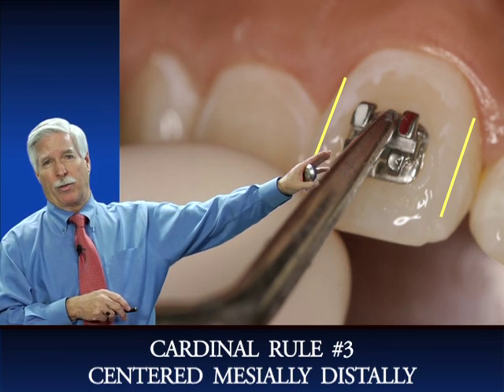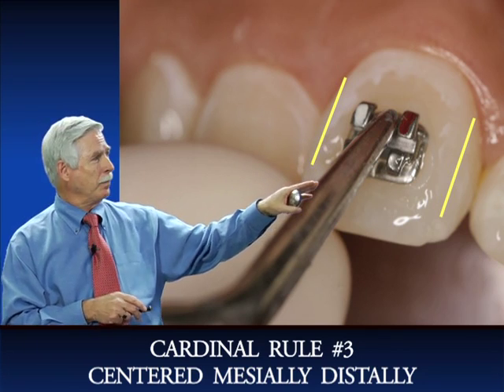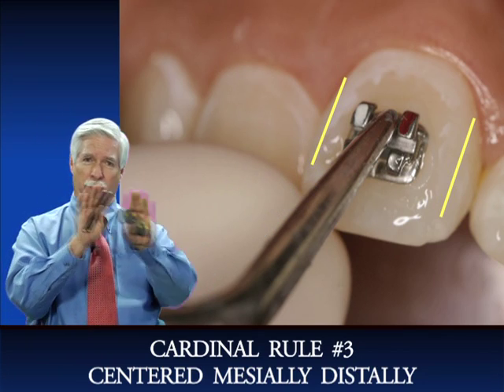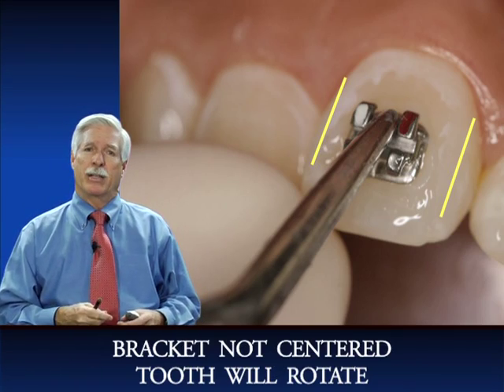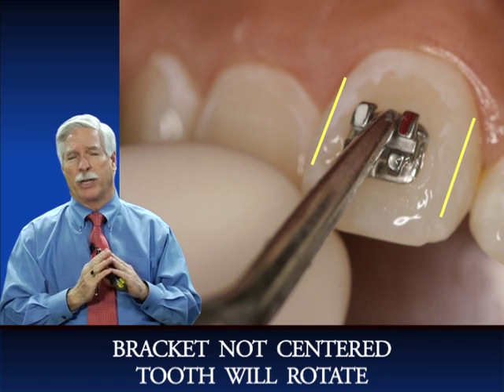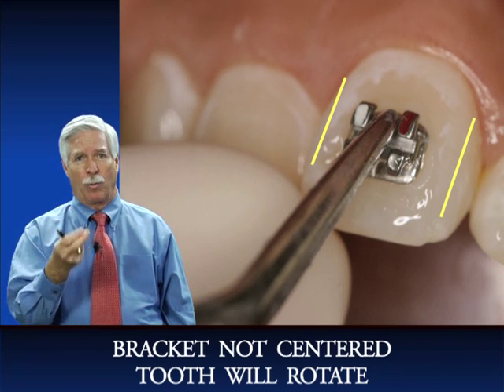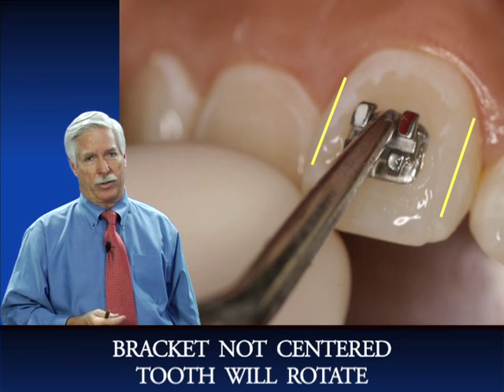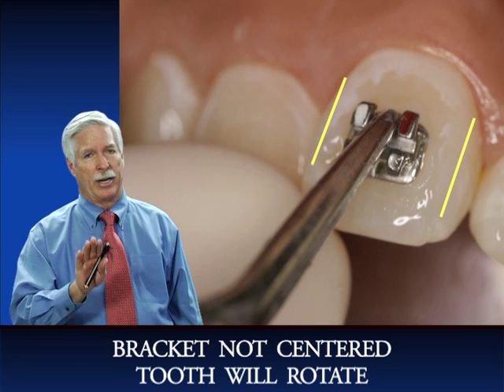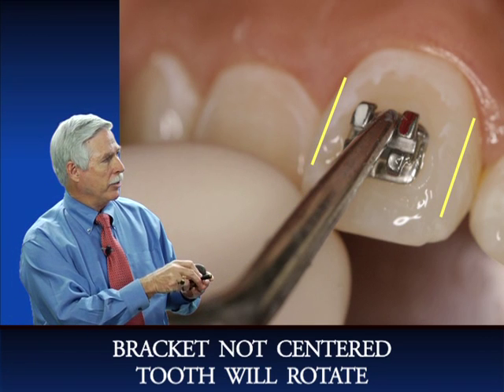Cardinal rule number 3 is the bracket must be centered mesiodistally. You don't want the bracket too far this way or this way. It's got to be right in the middle. If it's not, it'll rotate the tooth. If the bracket is too far mesial or distal, the result will be a rotation of the tooth. And we're trying to prevent rotations, not cause rotations. So make sure the bracket is centered mesiodistally. And you can see, here's the distal of the tooth.